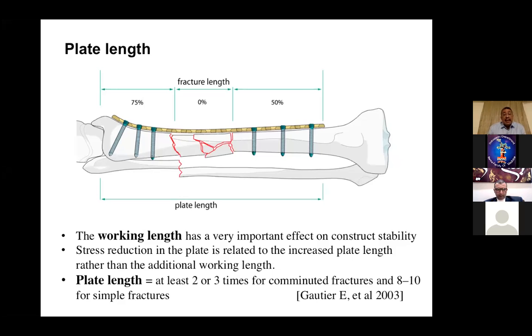The plate length is very important because the stress reduction in the plate relates to the plate length. The increased plate length will reduce the stresses over the plate. It is more important than the working length. Yes, working length is important because it has an important effect on the construct stability.